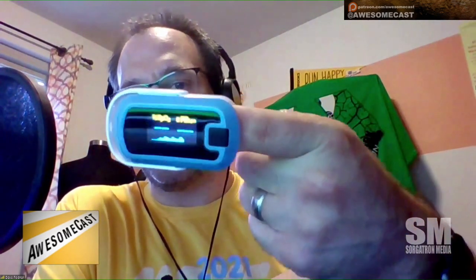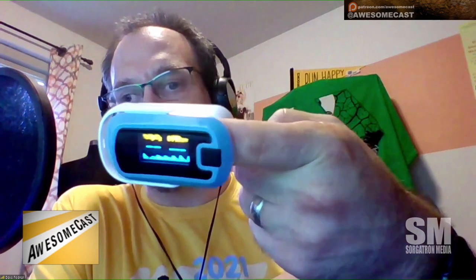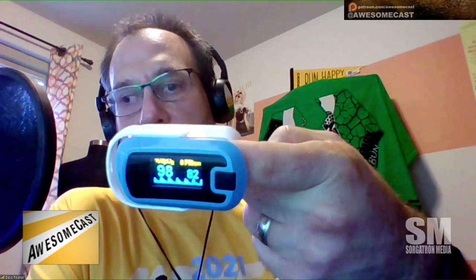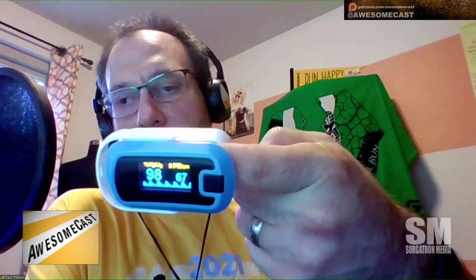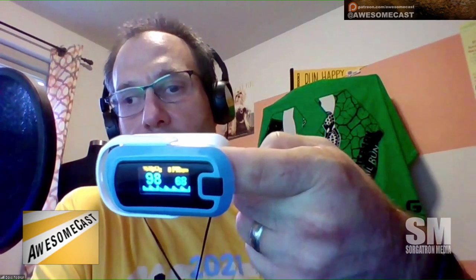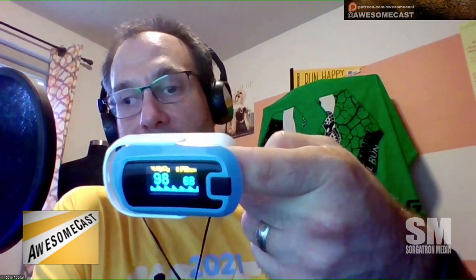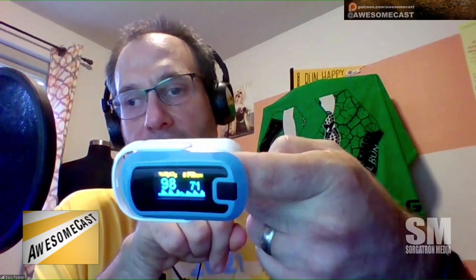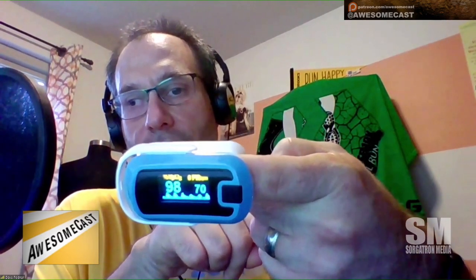It's a simple blood oxygen sensor — a finger one, just like they use in the hospital. Let me switch fingers here. You can see it's pretty instantaneous how quickly it shows your blood ox and your pulse. It even has a live graph of your pulse, not just an animation — you can actually see it changing in real time.